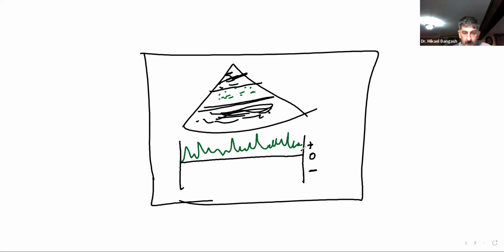But then here you will have different velocities. We can say 10 centimeters per second, 20 centimeters per second, 30 centimeters per second, 40 centimeters per second, 50 centimeters per second. So on this side here, the readings are going to be in centimeters or meters per second, which is just your speed.